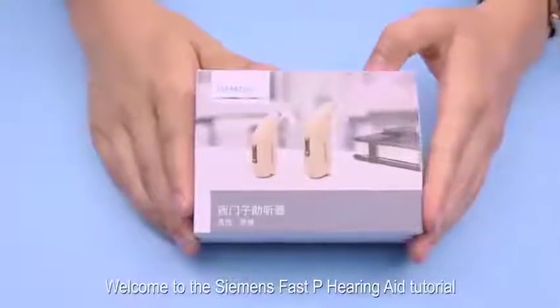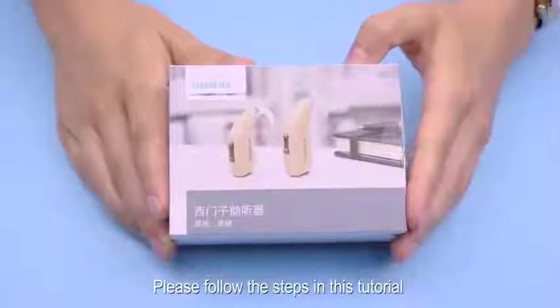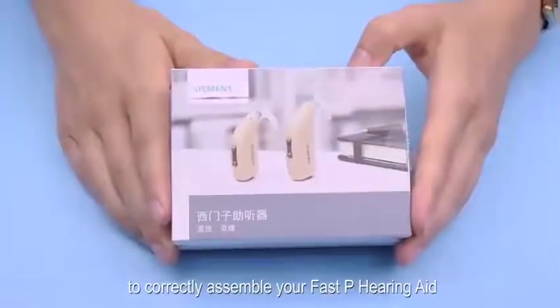Welcome to the Siemens FastP hearing aid tutorial. Please follow the steps in this tutorial to correctly assemble your FastP hearing aid.